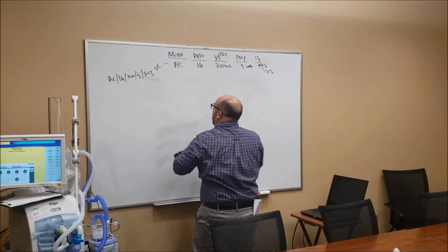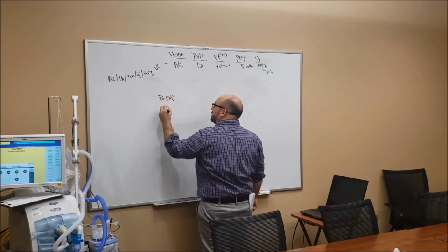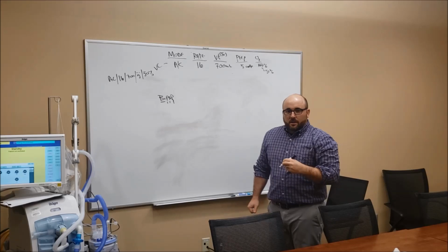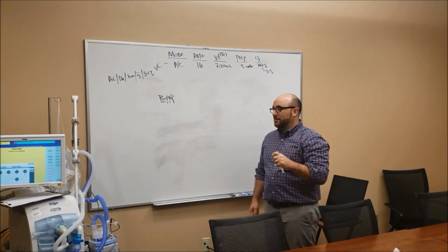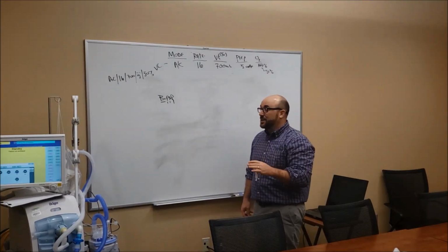So let's talk about BiPAP real quick because that's another one, and then we'll do some blood gases. Does anybody know what BiPAP stands for? Has anybody ever been on BiPAP? I think a prerequisite for anybody taking care of someone on BiPAP is that they should have to wear it, because it seriously is a different world.